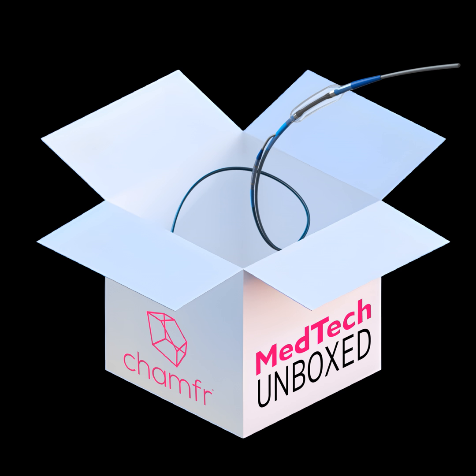I worked with great catheter design engineers that knew what they were doing and could design what they wanted, but it's a lot of design based on experience, based on past examples they've done, things they think will work. But when you ask to quantify and to iterate and to help understand why this design will work and why this one will not work, there's not a lot of great tools out there.